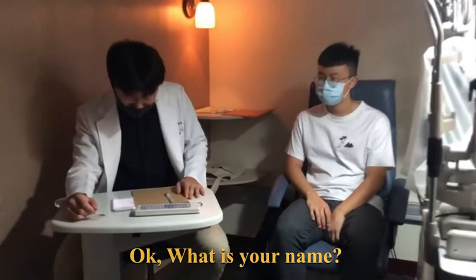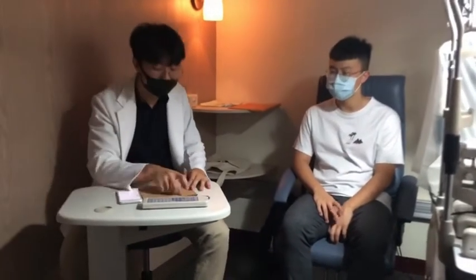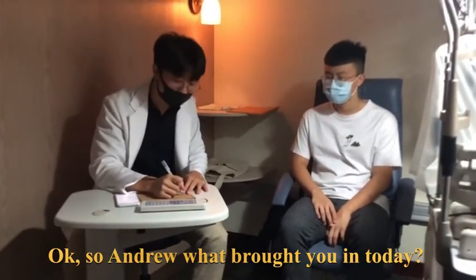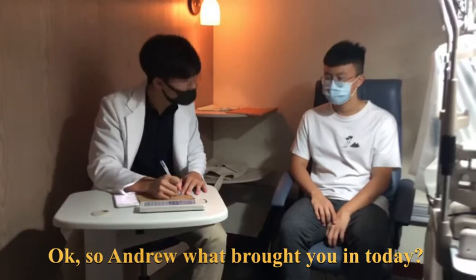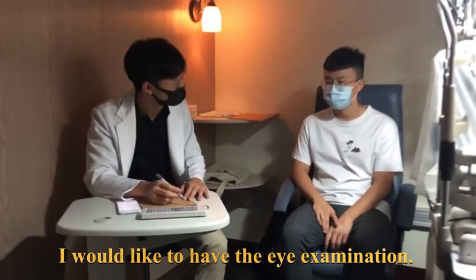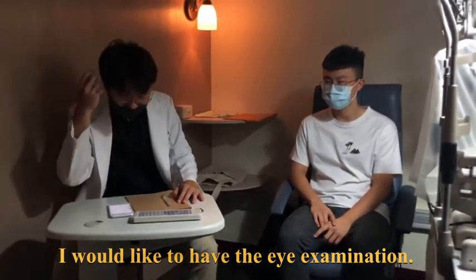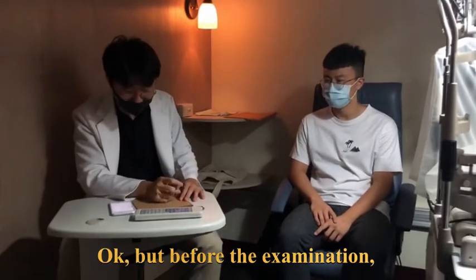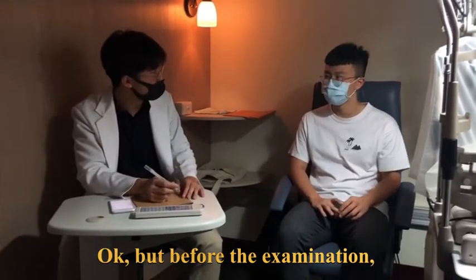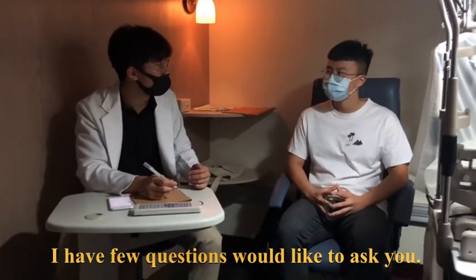Okay, what is your name? My name is Andrew. So, Andrew, what brought you today? I would like to have the eye examination. Okay, but before the examination, I have a few questions I would like to ask you.